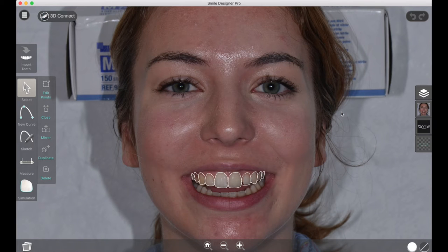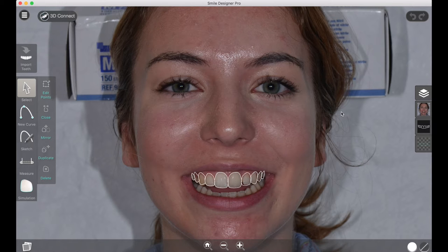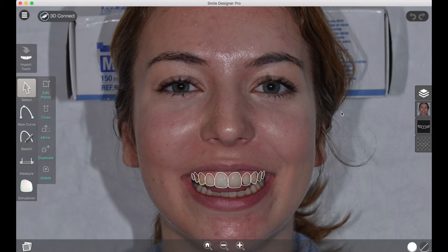Hi everybody, this is Gil with Smile Designer Pro. Today we're going to cover a supplementary tutorial on the new feature introduced in Smile Designer 2.1. If you haven't already watched our introductory webinar, we recommend you start with that first to get an overview of all the features. Today we're going to cover a special feature in our simulation tool which allows you to use the patient's own tooth color as a source for simulation.